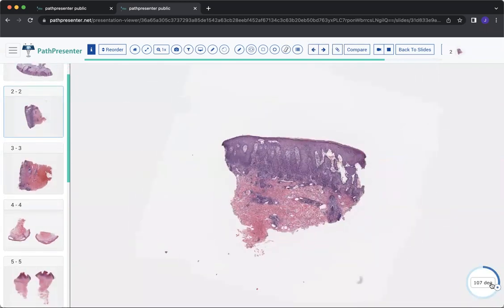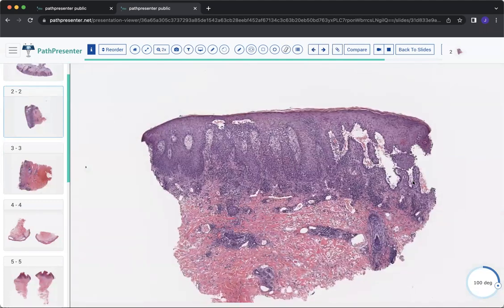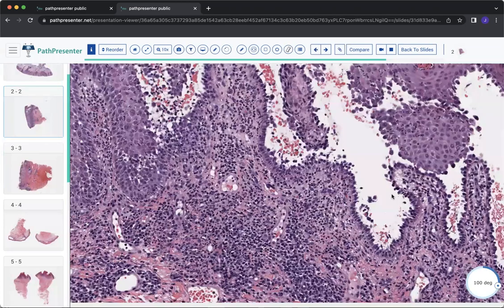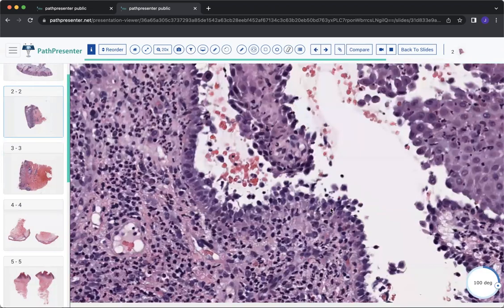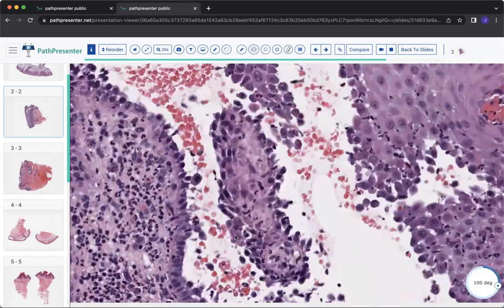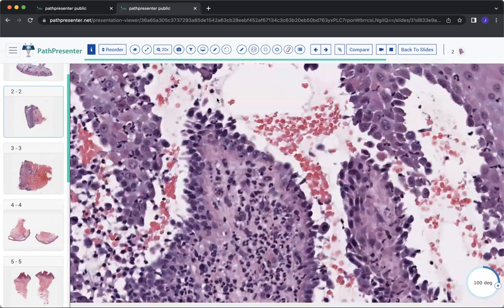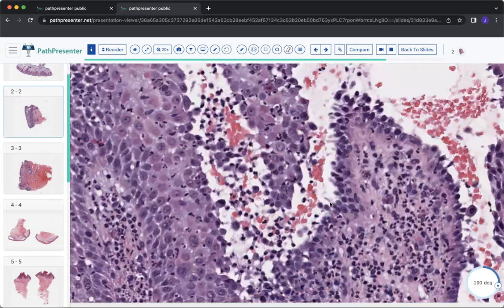Number 2. So here you see a punch biopsy. You notice this bullous cavity already to the right. You go in higher power, and you start to notice that the keratinocytes are almost forming a single layer in much of it here in the classic examples. They're sticking up a little bit, and people call that a tombstoning pattern. So with the buzzwords, you're already probably jumping to the diagnosis.